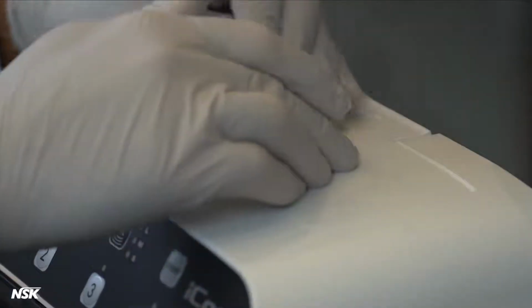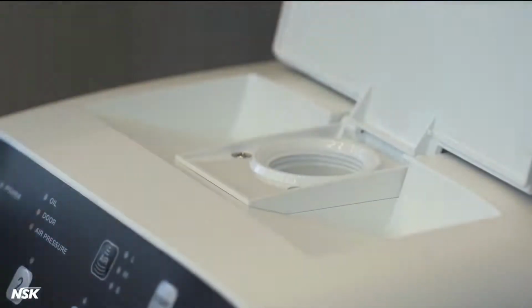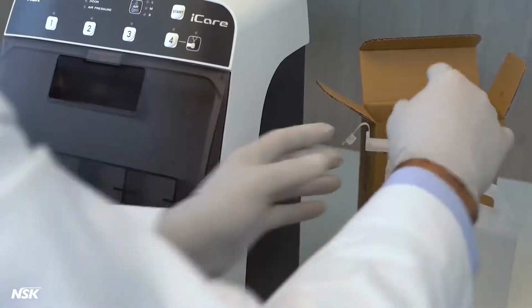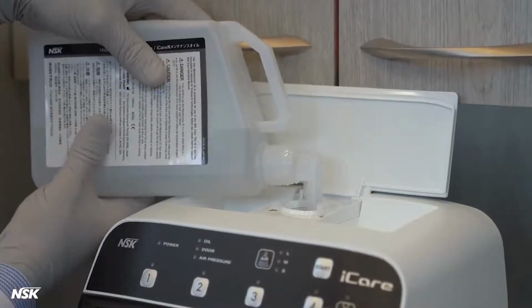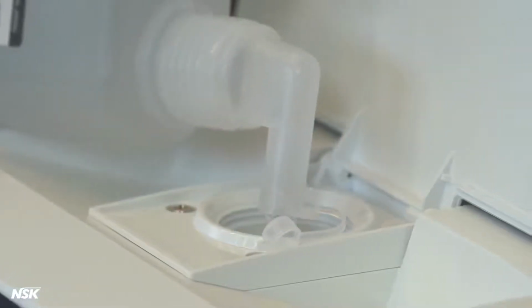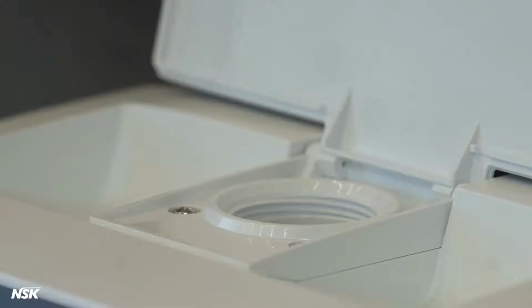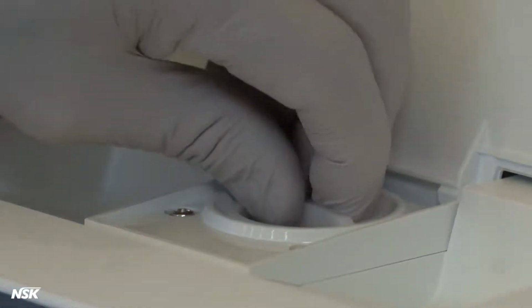Remove the sticker with priming instructions from the top of your iCare. Open the top cover and remove the cap on the oil tank. Insert the nozzle into the bottle and slowly pour the entire bottle into the tank. The oil tank capacity is larger than the amount of fluid you will be adding, so it will not overfill. Put the cap back on top of the tank and tighten by turning clockwise.